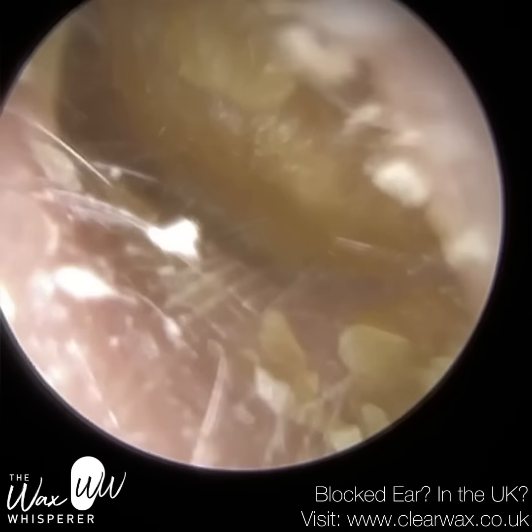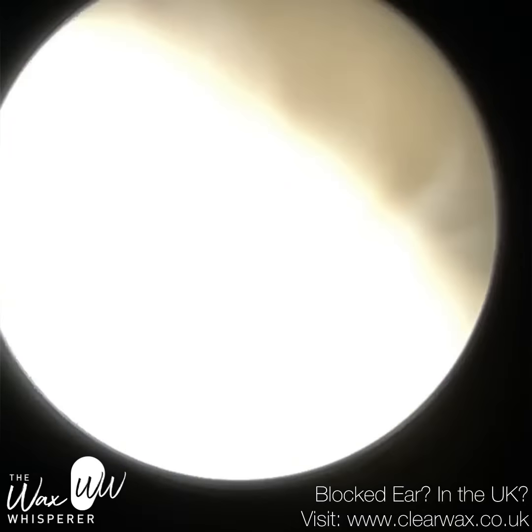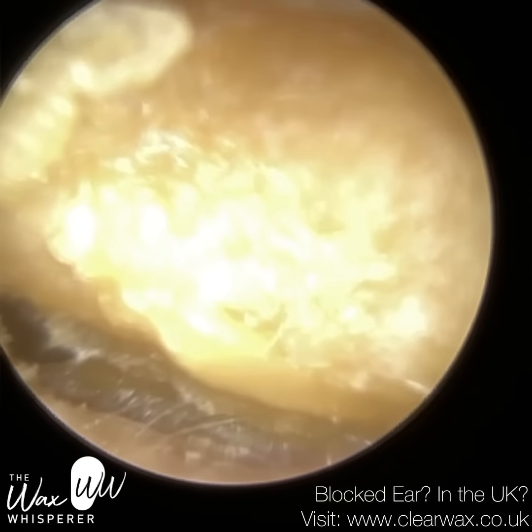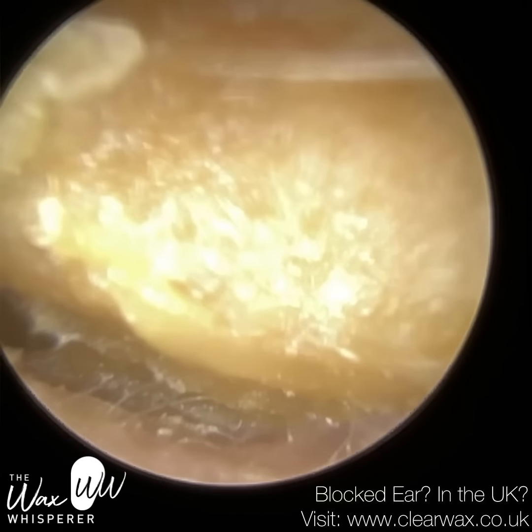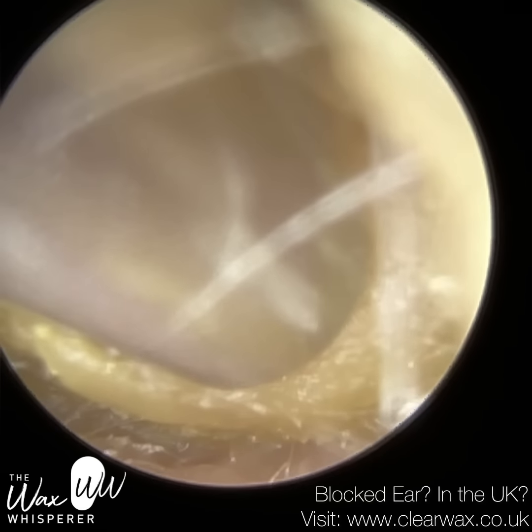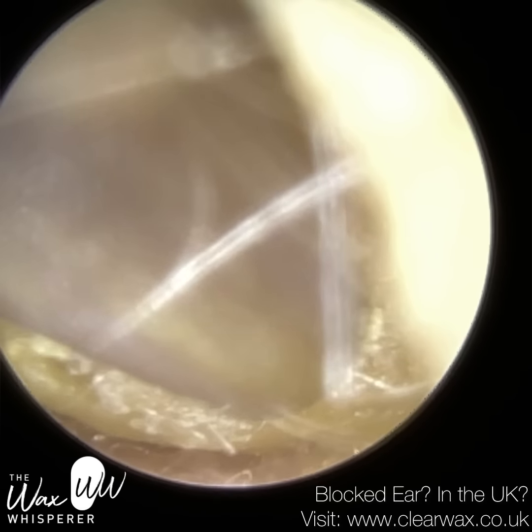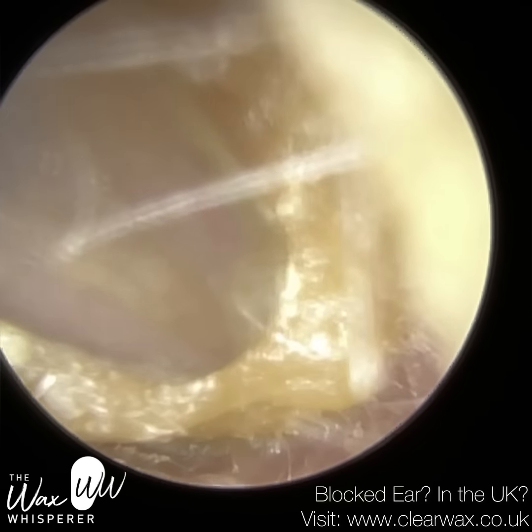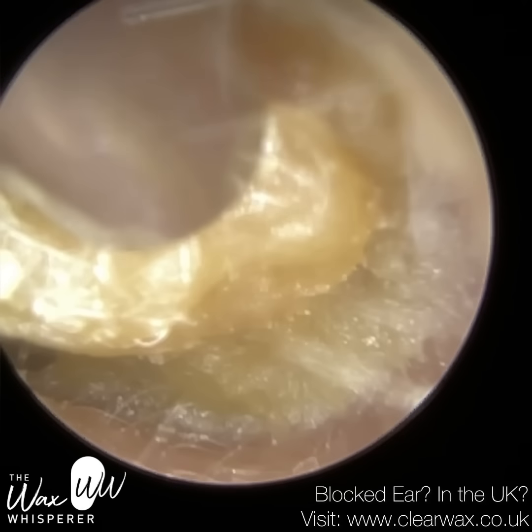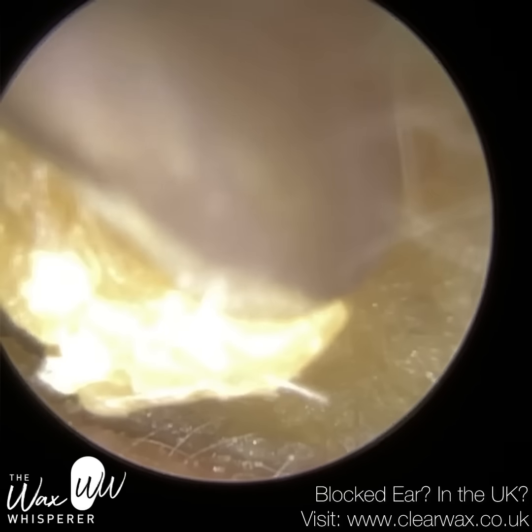We have here a patient who attends perennially. They suffer from chronic otitis externa, and as a result they get this accumulation of dead skin, so keratin, that forms into a plug. Given the entrance of the ear in particular is quite narrow, this excessive dead skin turnover is not able to naturally migrate out of the ear, and instead it collects, and this plug of dead skin, keratin, has many different consistencies.